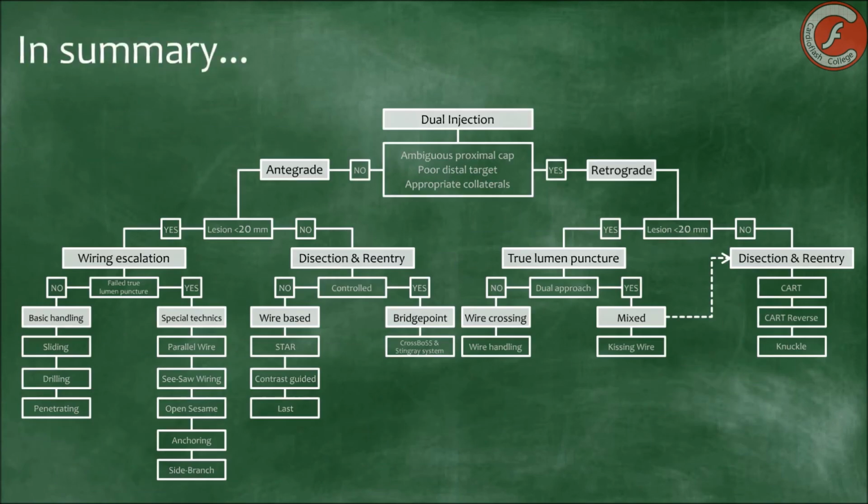In summary, the treatment of chronic occlusions is one of the most complex challenges of coronary interventionism. For these reasons, it is convenient to dispose not only of the appropriate instruments, but the necessary experience in order to be able to use them properly according to the different available techniques and the features of each case.